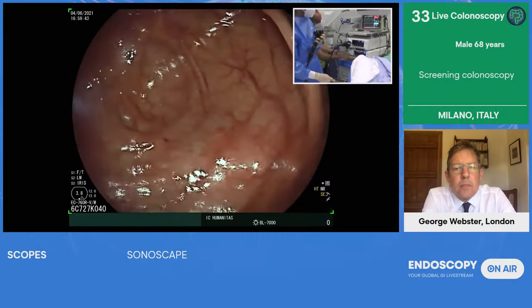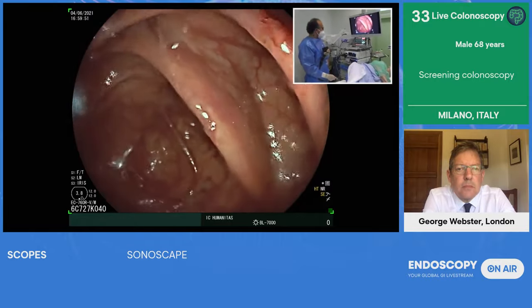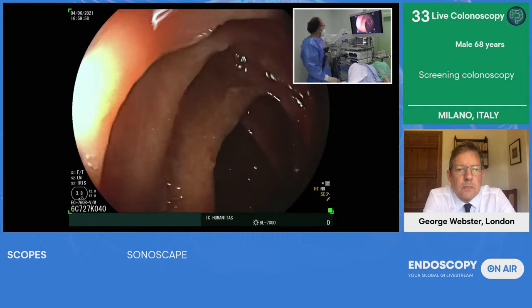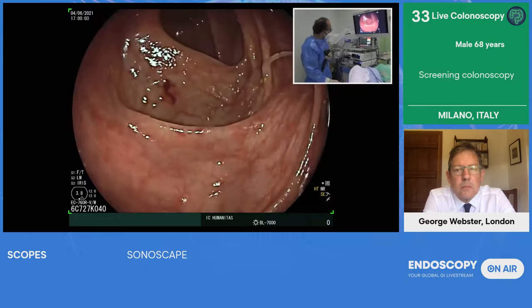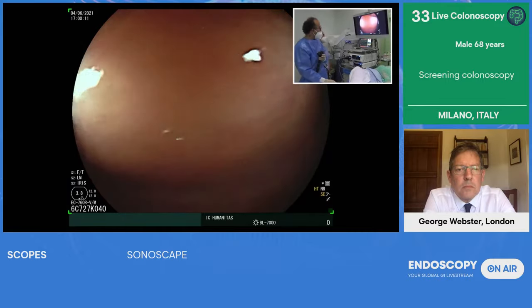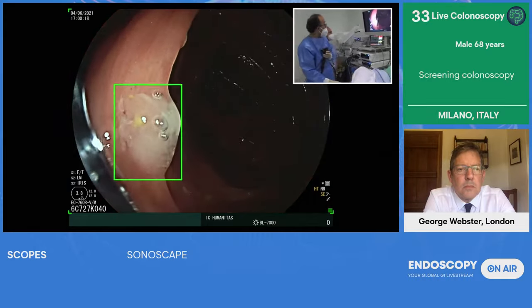Now I have the balloon, and I can feel a bit of resistance when I withdraw, but this is exactly the purpose of this. As you may see, I can expose behind the fold. Here is where you have the miss rate of lesions that you need to avoid. And I feel that this balloon is a very interesting addition to a standard colonoscopy. I'm going now in a spiral way, looking behind each fold. Of course, it's not always easy, and there are some corners like this where it is easy.